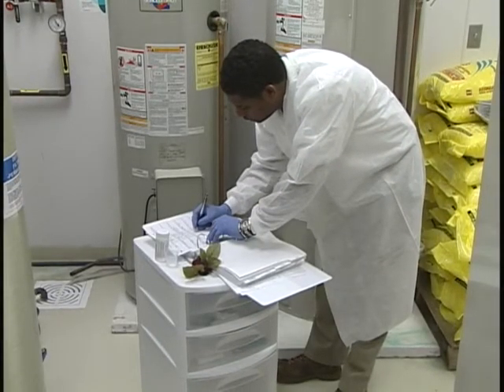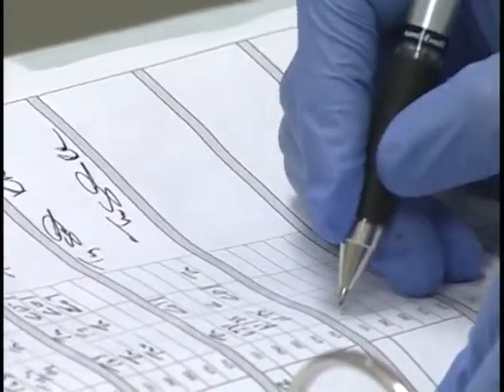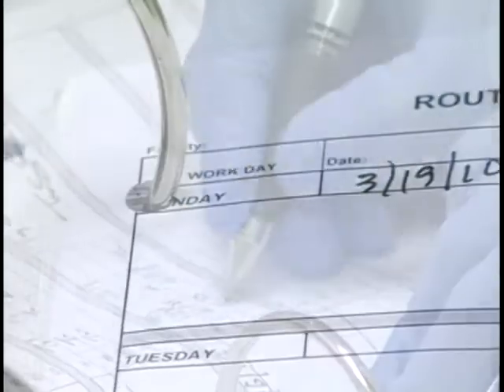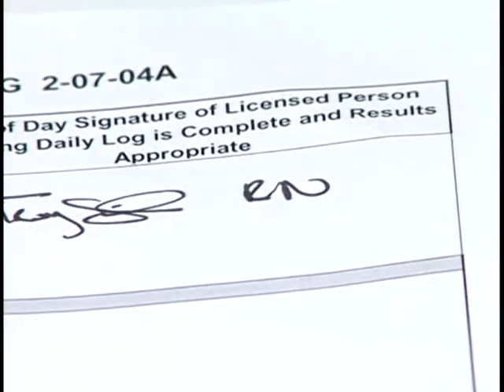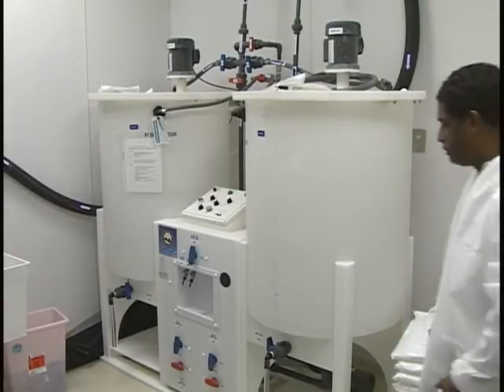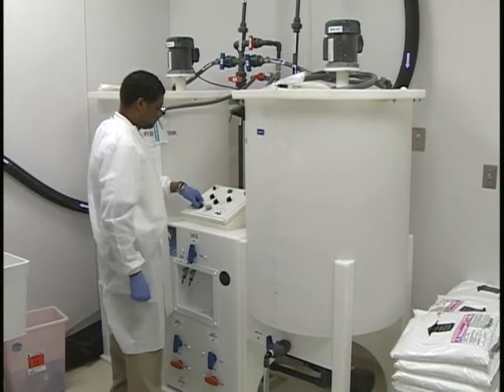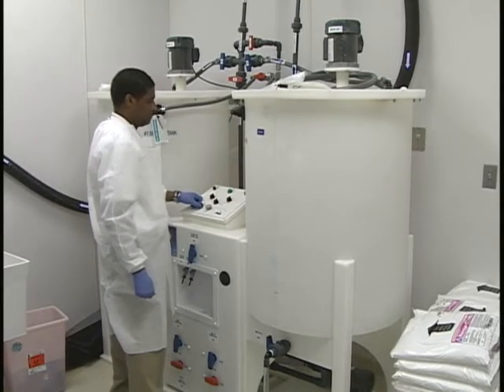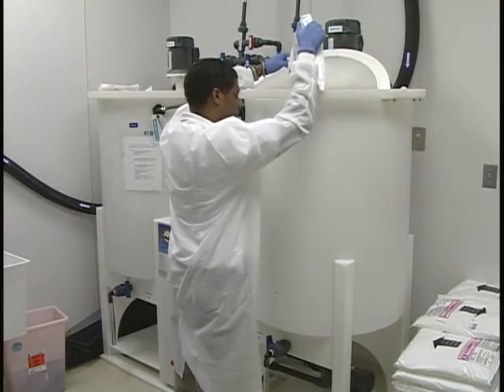Your survey of the water treatment area should include a review of the testing logs. The logbook should document the test dates and times, who performed the tests, and the results. Once it is purified, the now dialysis quality water must be mixed with chemicals to create a dialysate which corresponds as nearly as chemically possible to the patient's blood plasma.